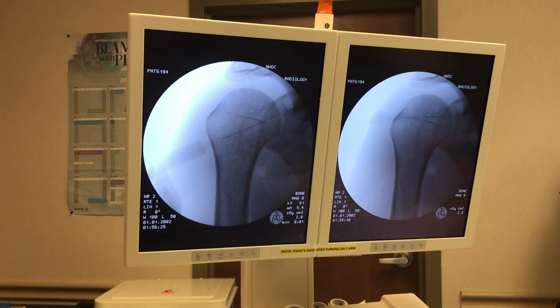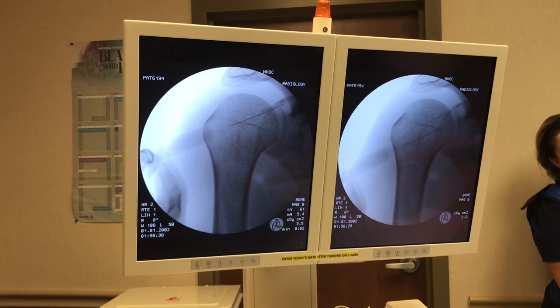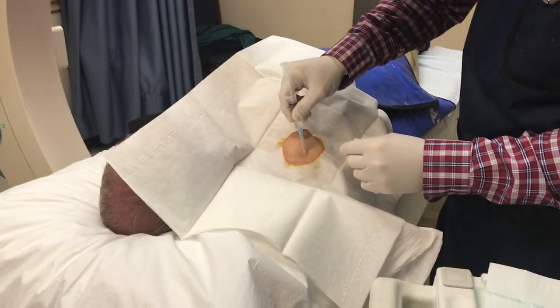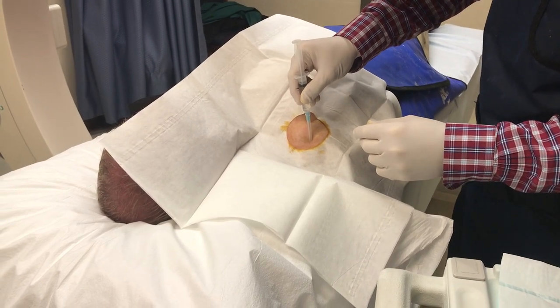We're going to move that needle again. Now move over a little bit — X-ray. You can see I'll make a little mark in the shoulder where the needle's going in. I have my placement at the superior humeral head there.